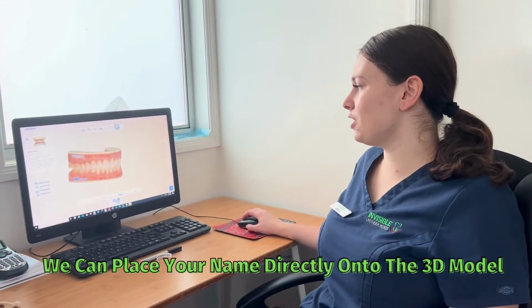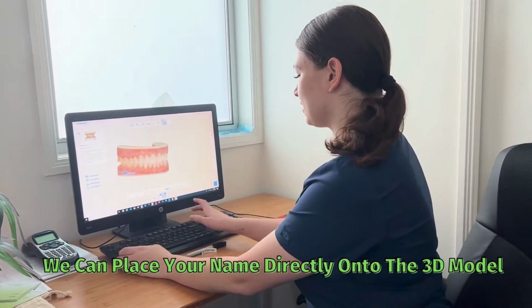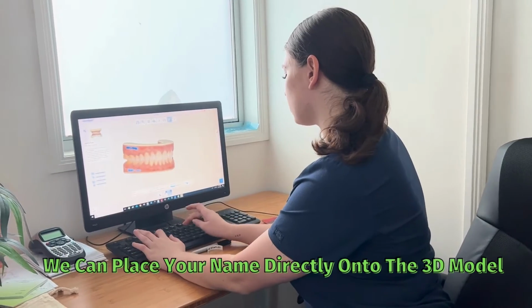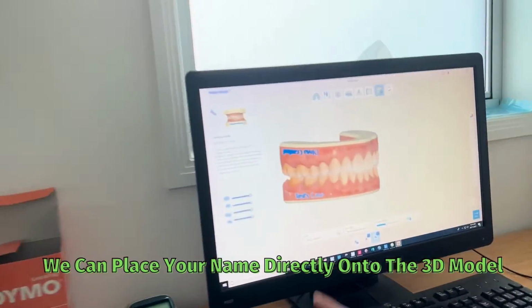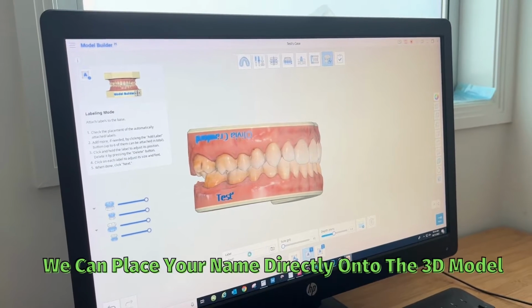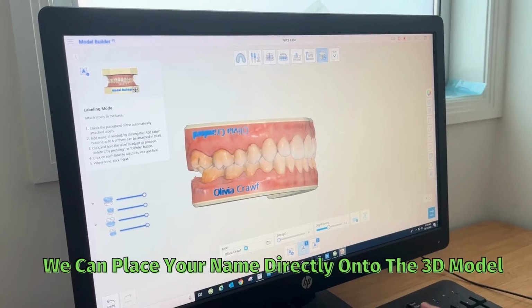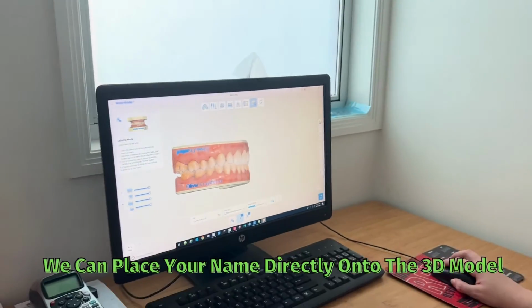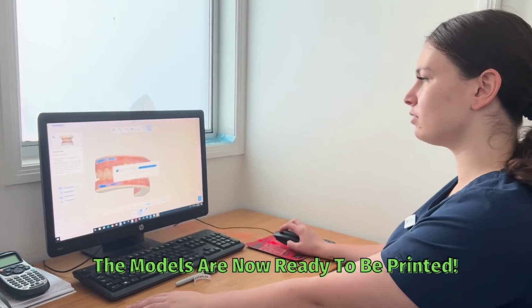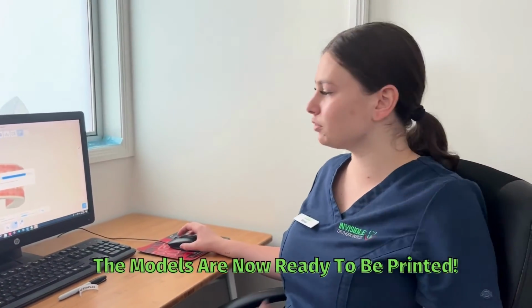So when it comes to naming the models, I just like to click on one of them and put the full name of the patient on the top, and then we move on to the bottom. And we can move it around like so, and then that's how the models are done. And then they just need to be put onto the actual software for the printer.